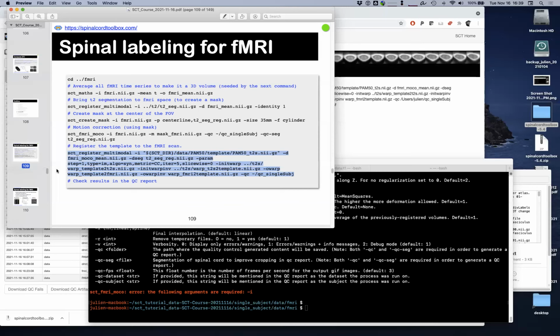So one school of thought is that if you are going to smooth later on, why not acquire the data with a coarser voxel and not smooth? Because acquiring with coarser voxels helps you to reduce the matrix size and reduces the susceptibility distortions, rather than acquiring at super high resolution with noise and then smoothing later on. Right?